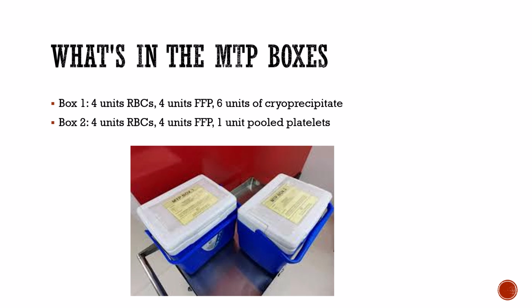You can either do a protocol-driven resuscitation where you just give what's in the box, or you can do a slightly more tailored approach where you use ROTEM amongst other things to work out what is it that this patient is missing, and can we target that to replace that.